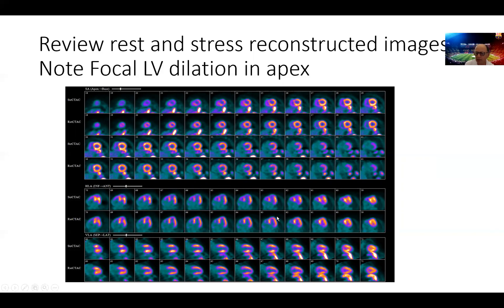Now remember, with PET, we're imaging right at peak stress, the patient is in the machine at peak stress, in contrast to SPECT where we image these patients a while later after stress. So this is true post stress or peak stress imaging.